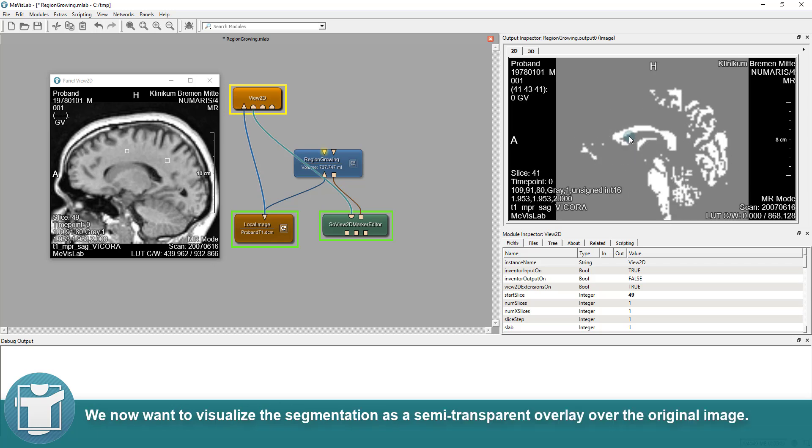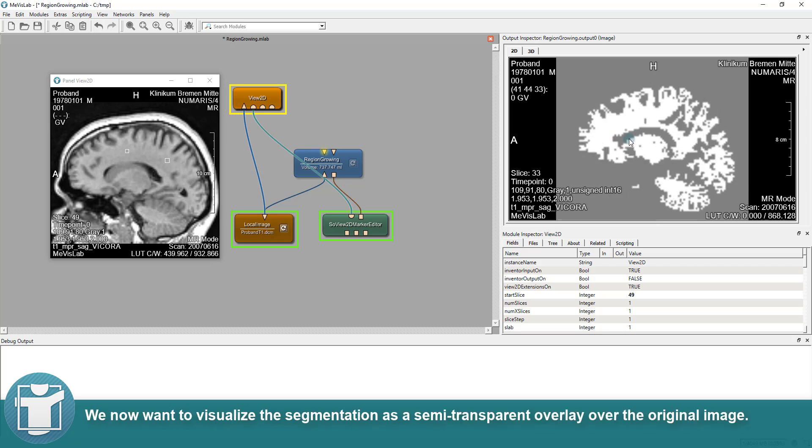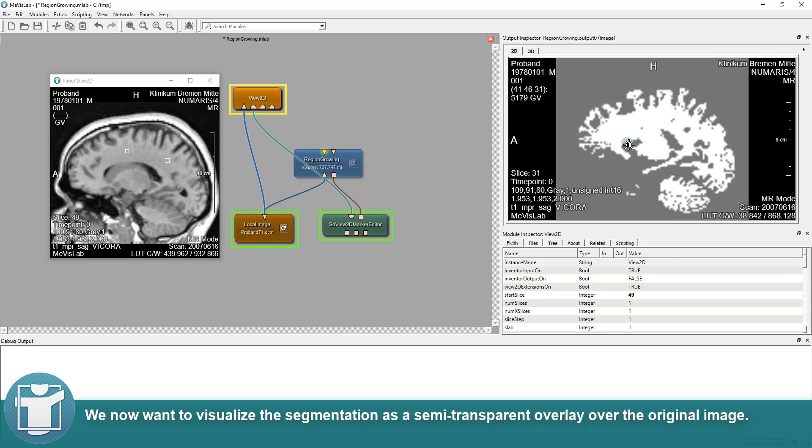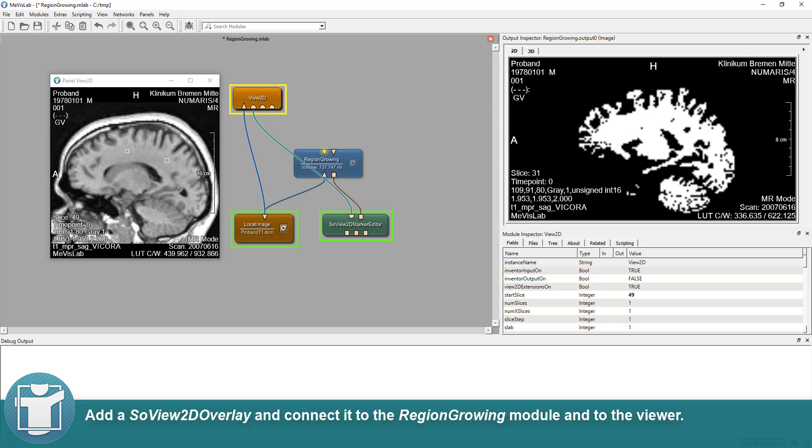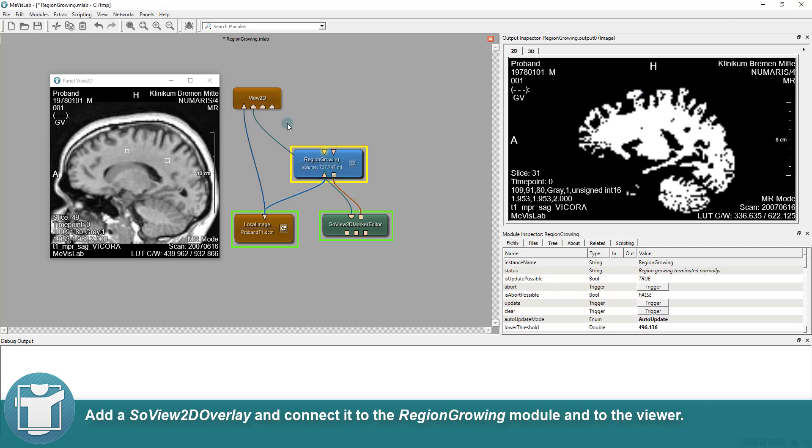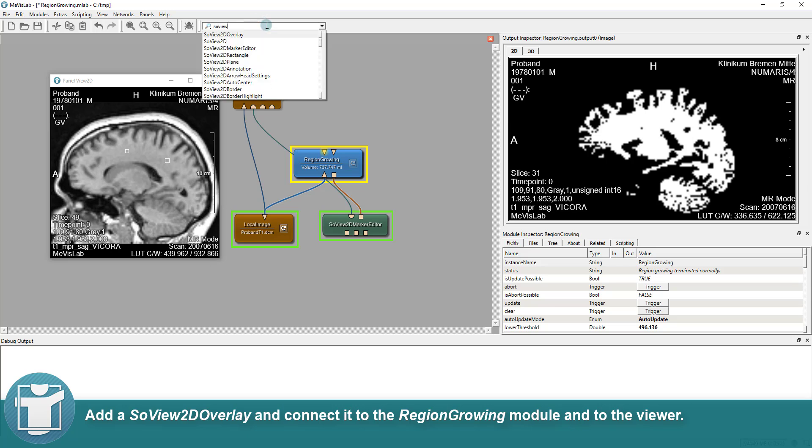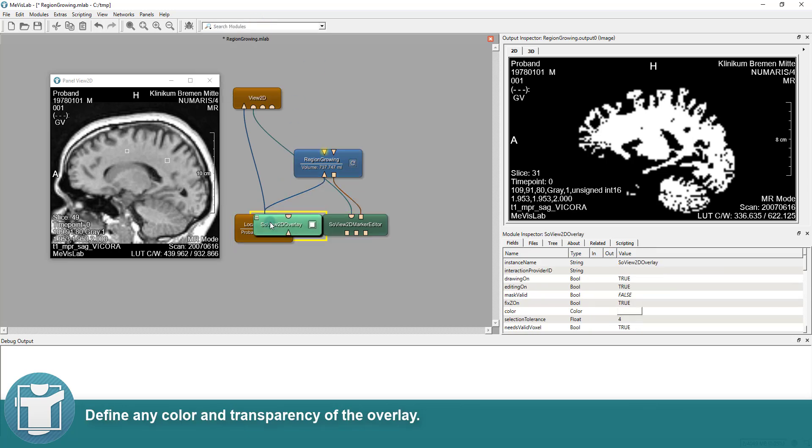We now want to visualize the segmentation as a semi-transparent overlay over the original image. Add a SoView2D overlay and connect it to the region-growing module and to the viewer. Define any color and transparency of the overlay.